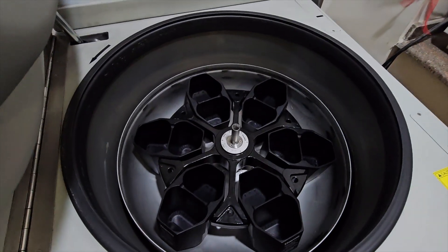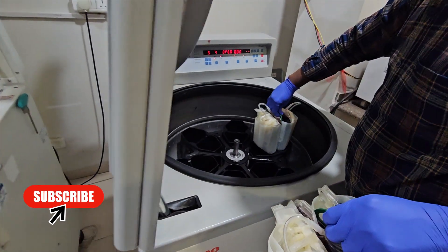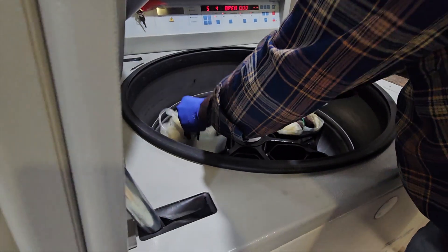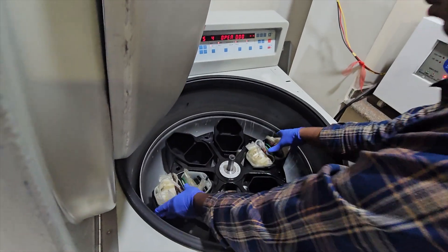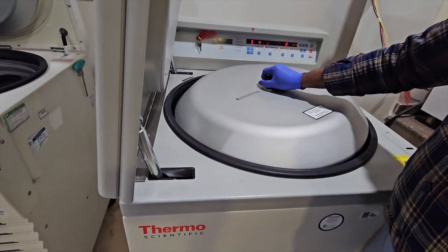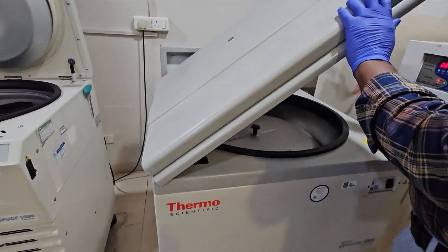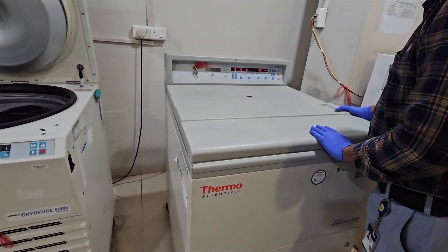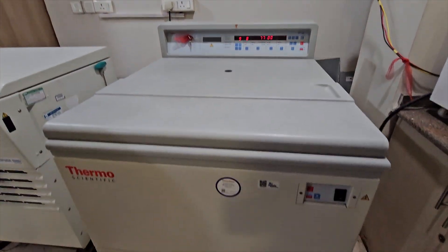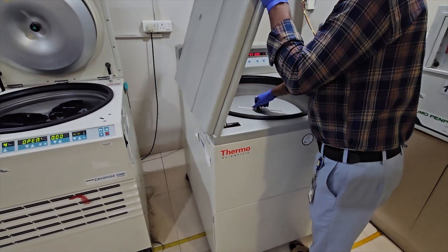This is the centrifuge chamber. Buckets are placed inside the chamber. Now the machine is put into a hard spin centrifugation at 22 degrees centigrade for around 8 minutes.